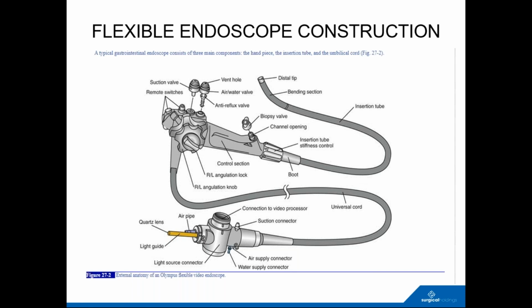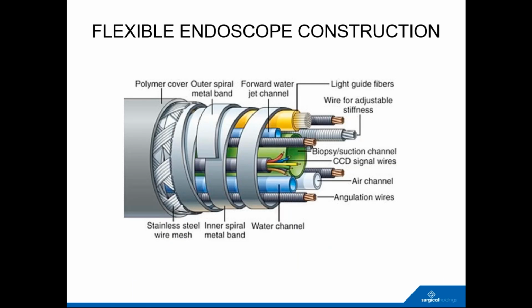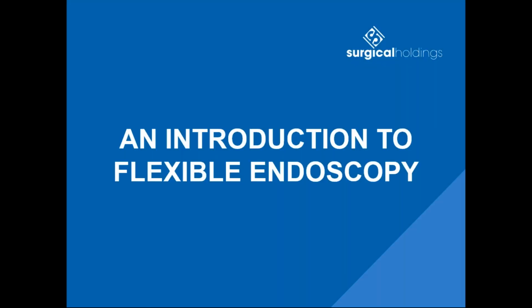So leak testing is obviously important from that perspective. Excellent. And Brian's followed up with a question, just around again on the ingress of fluid. Is that removed by a standard cleaning? Would you know? No, no. If you get fluid inside, it really needs to go back to the manufacturer for sorting it.